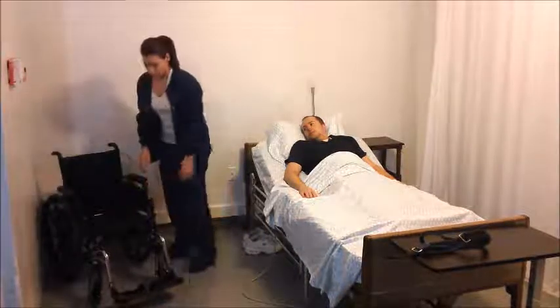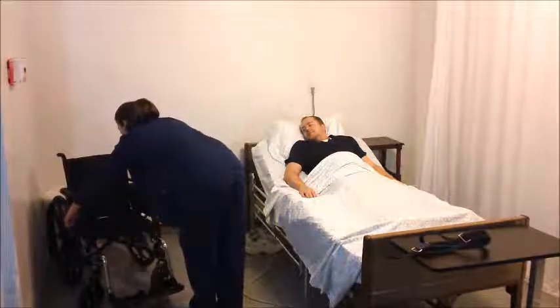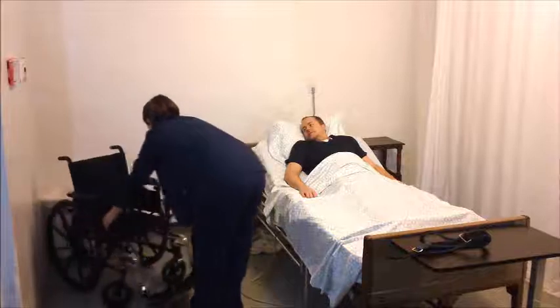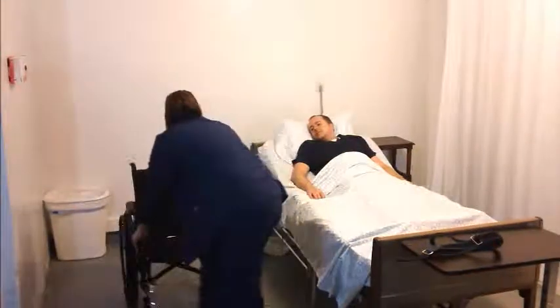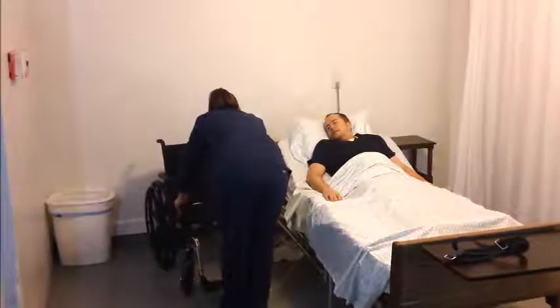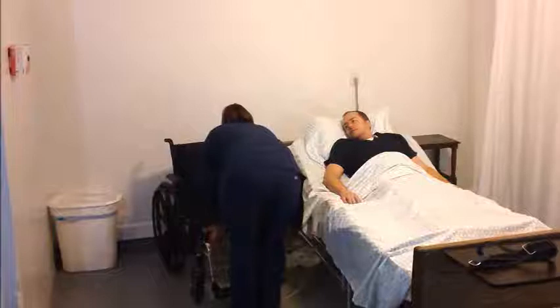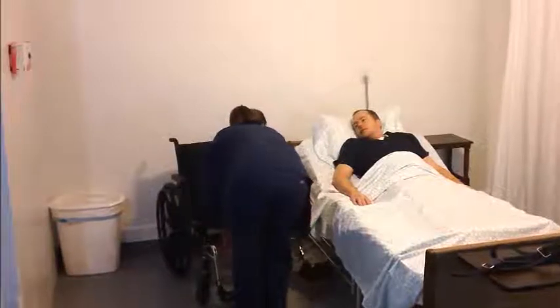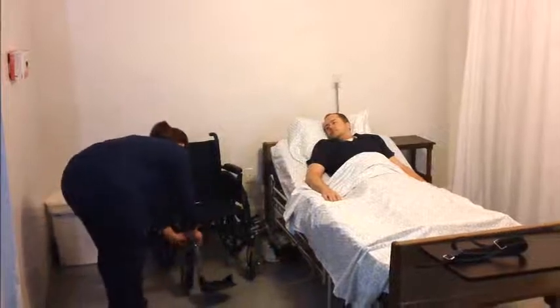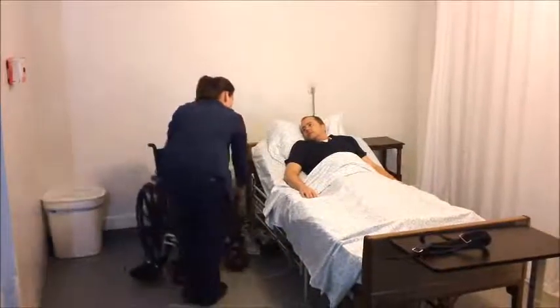Position the wheelchair alongside the bed at the head of the bed facing the foot, or at the foot of the bed facing the head. Position the wheelchair so that the front interior wheel is close enough to the bed so that the transfer can be completed as a pivot. Move the wheelchair footrest out of the way before standing the client for transfer. Lock both wheels of the wheelchair and check to make sure the bed wheels are locked.